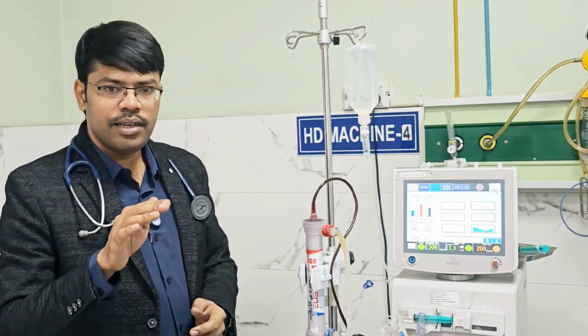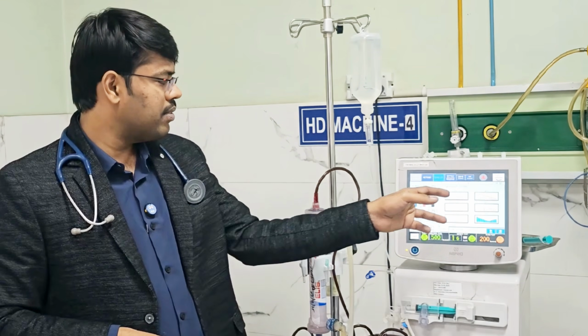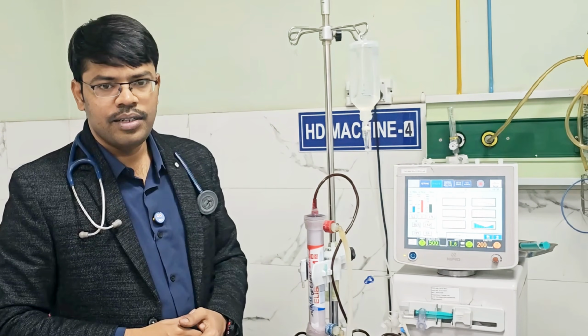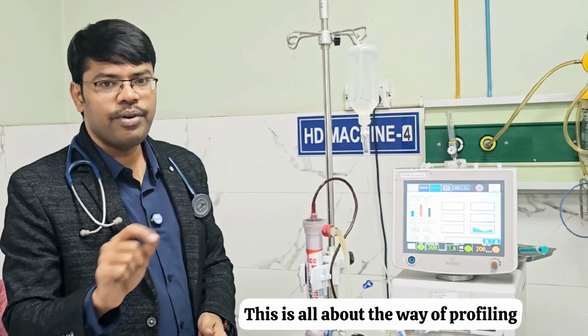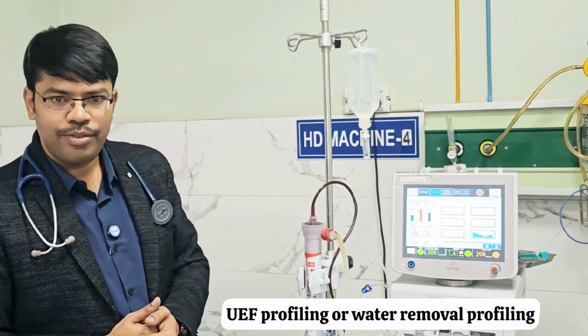Most of the situations, a constant ultrafiltrate will be removed. Only in some situations, these kind of graphs we will select. This is all about UF profiling. UF profiling or water removal profiling.